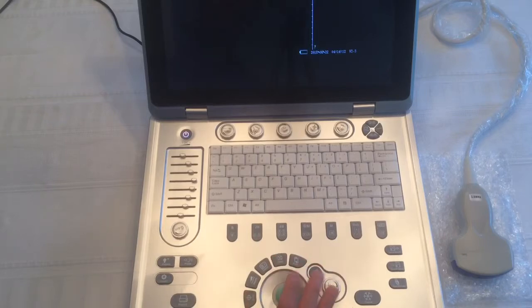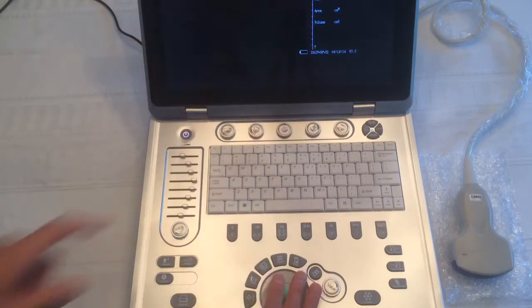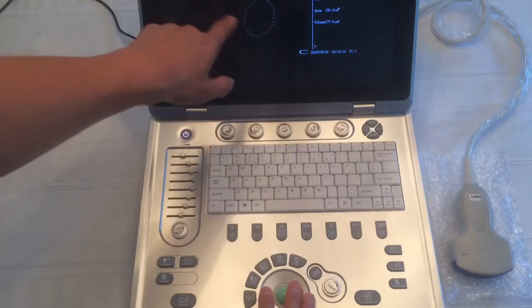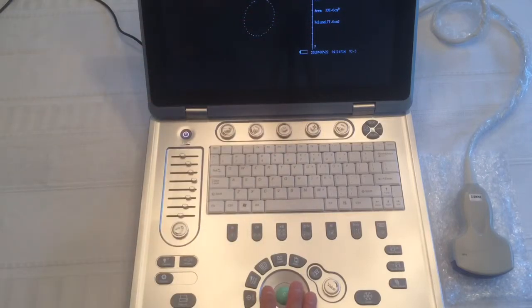To measure volume, let's clear that. Again, you press measure. This time you press once, twice, 3 times, and you see volume. You move the ball to the initial starting position, press enter, and then you move it to the other side. Okay, press enter, and then you use the ball to estimate the area, and then it will give you the volume. Okay, so that's how you do the volume.